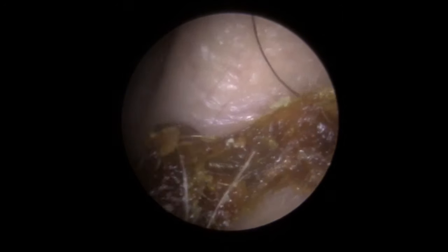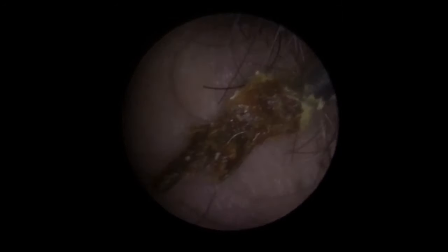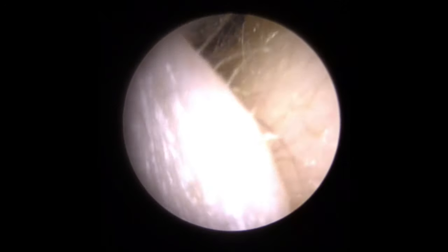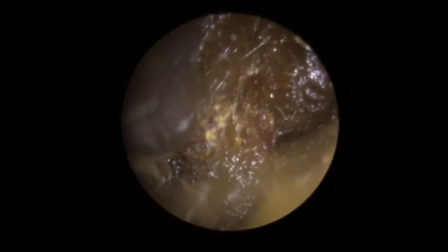I've slowed this down — it's a little bit easier to see with some of these little hairs on the outer part of the ear canal. There we are — you can see it pulling, stretching and pulling the remainder of the wax down. We've taken that piece there — you can see how long that piece was. It was attached to the left-hand canal wall and went down the left-hand side of the wax. So when we look back in now, you can see we've actually detached it from a lot of the canal walls just by removing that one piece. But it is still quite stuck at the base.